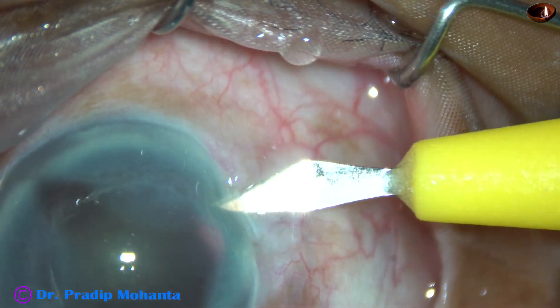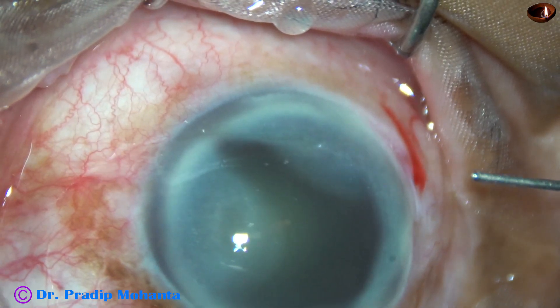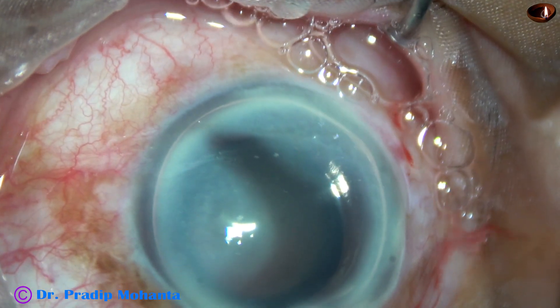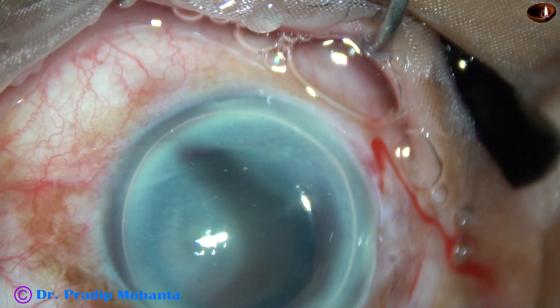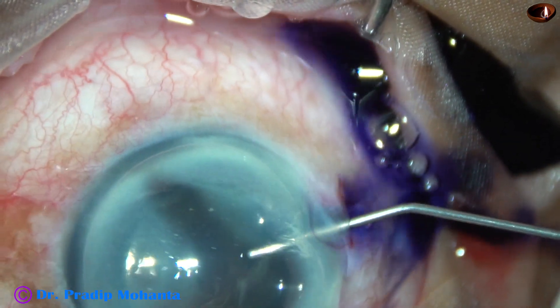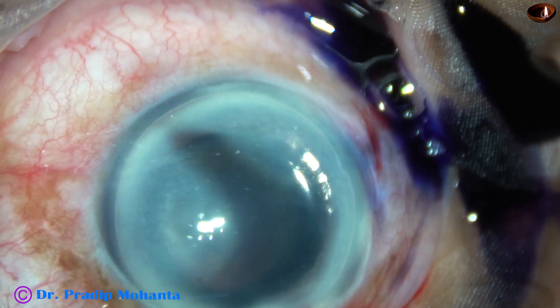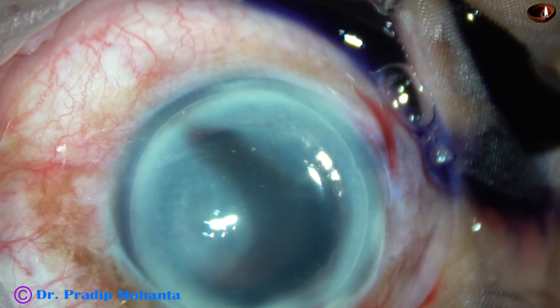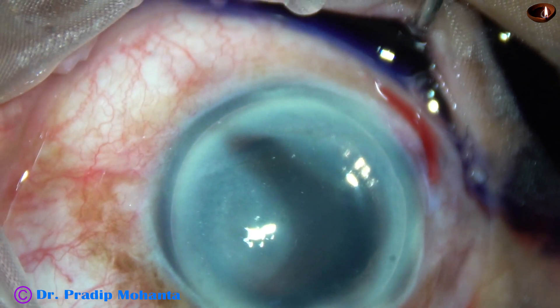Now this is a side port — a very small side port on the right side of the main incision. This is an air bubble. I want to stain the anterior capsule nicely in this case so that capsulorhexis becomes easy. And here goes the trypan blue dye underneath this air bubble. If we stain underneath an air bubble, the dye stains the capsule immediately and we need not wait for a long time.